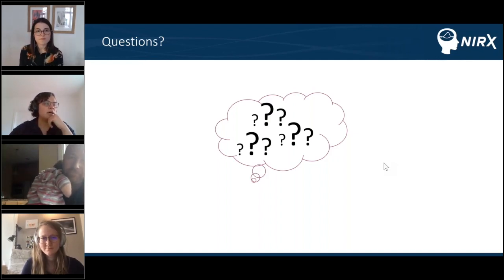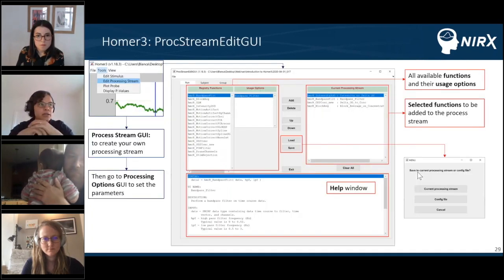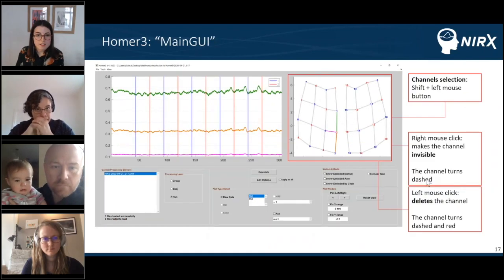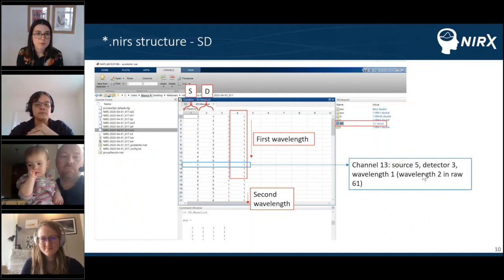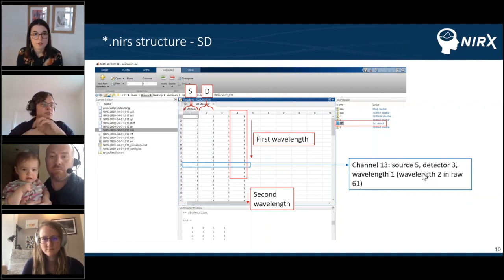Thank you, Blanca. Another question about your presentation: an attendee missed what is in column 3 of the SD list. According to the Homer2 documentation, this is an unused column, and it's all values of 1, so it doesn't contain any important information for our probe montage.